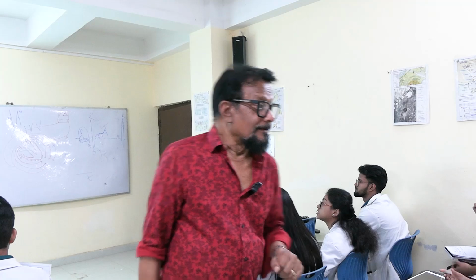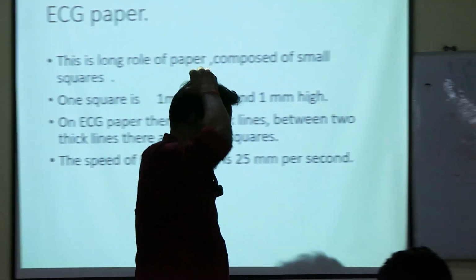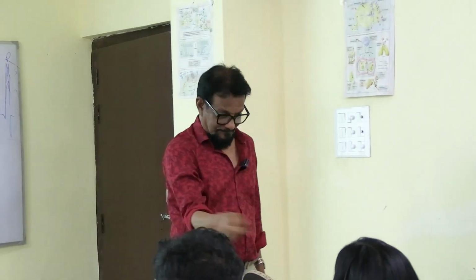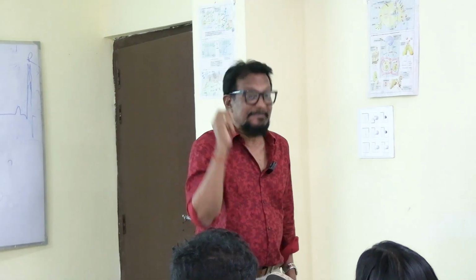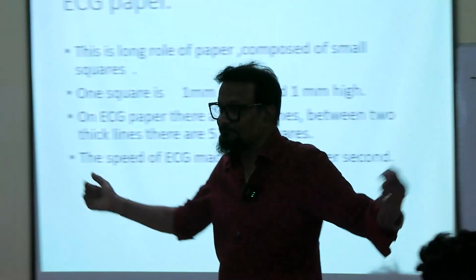In this way, we can determine in the ECG different durations, intervals, and segments.